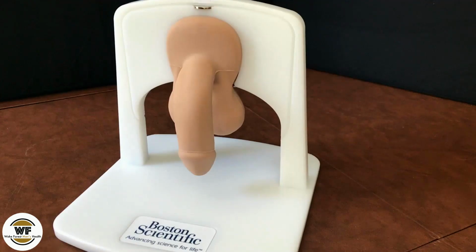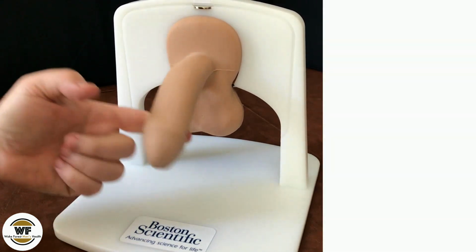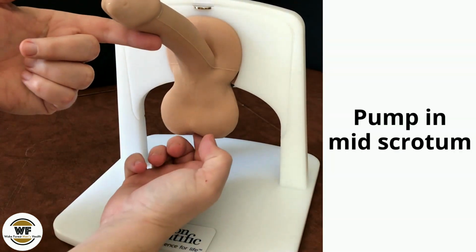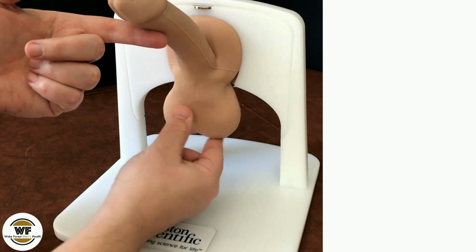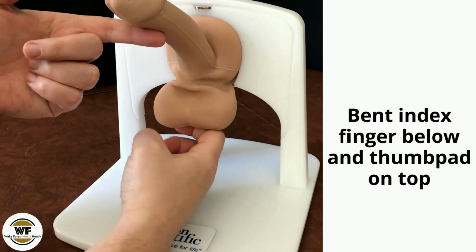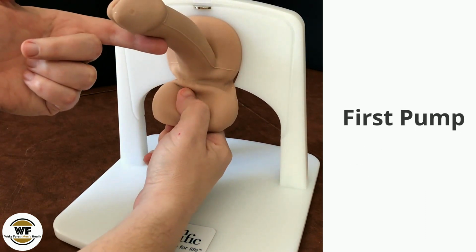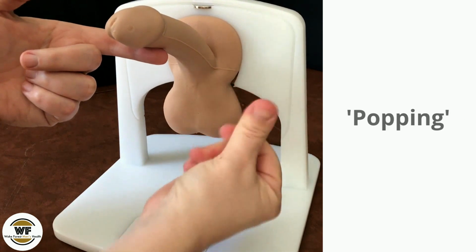Let's demonstrate this with a model of an actual AMS 700. First, we easily locate the pump in the mid-scrotum. Instead of fingertips, I'll use a bent index finger below and thumb pad on top. The first pump moves the valve and feels similar to popping a piece of bubble wrap.